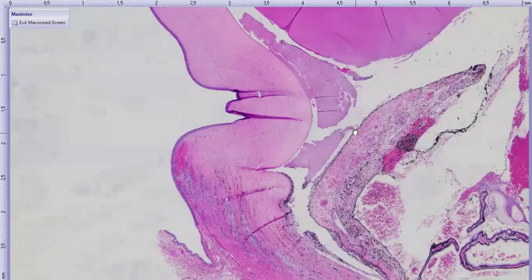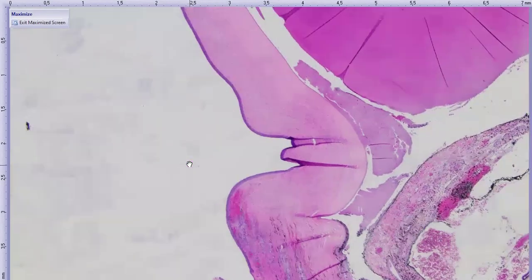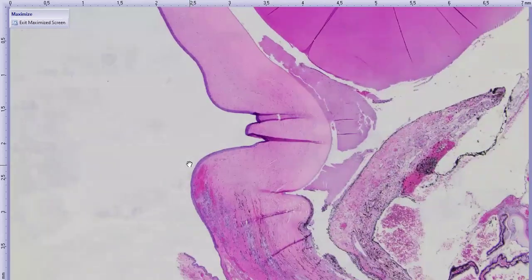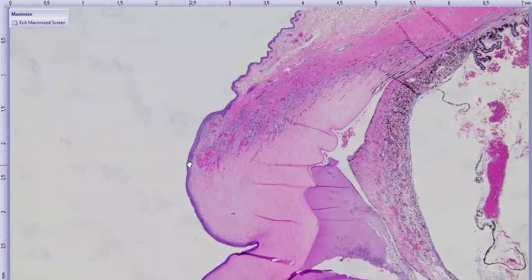So starting at the anterior segment of the globe, our cornea will be on the left, and then our posterior segment is going to be on the right. We'll move back that direction. There is some pretty mild vascularization coming in at the periphery of the cornea. This is a fairly acute timeline. I guess I didn't mention that, between when the trauma was sustained to the eye and when the eye was enucleated, about 3 days. So that's pretty fitting that we don't have too much vascularization.